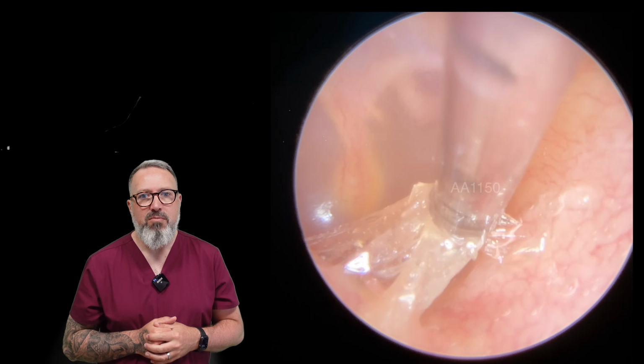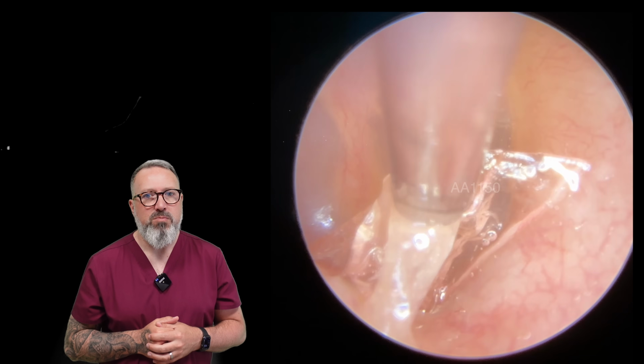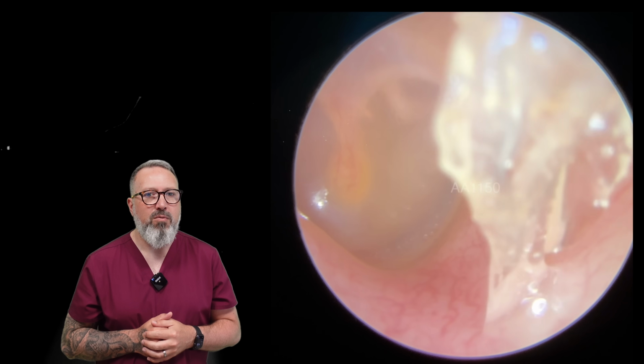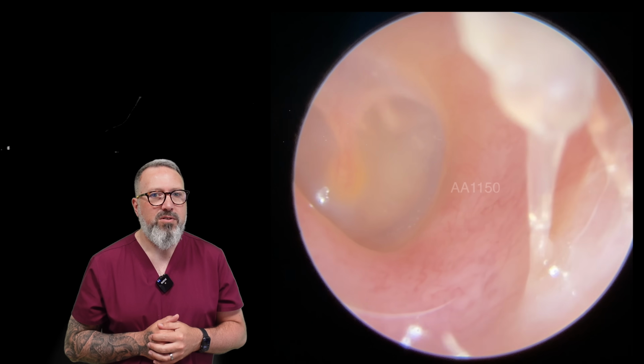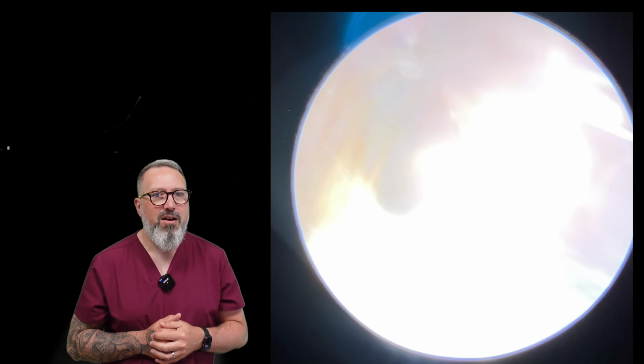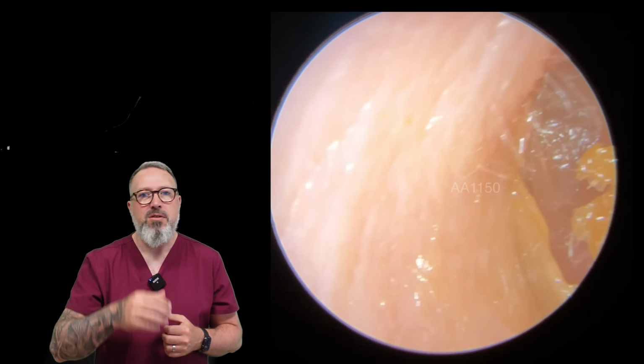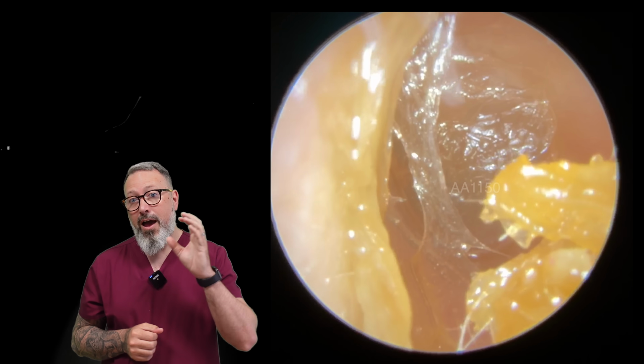And we just do the same thing. We just get a grip and we just peel it. It's almost got that cling film kind of look about it. And there we go, out. We'll just get to the end. And there we are, out that comes. Unfortunately, it had a little bit of oil on the way out there, but it was just a very thin wispy piece. But looking so much better in there after the procedure.